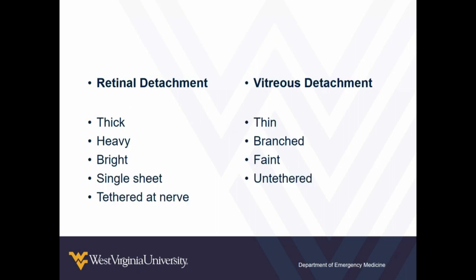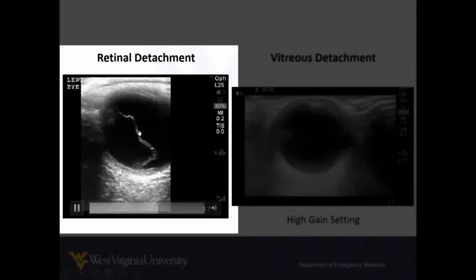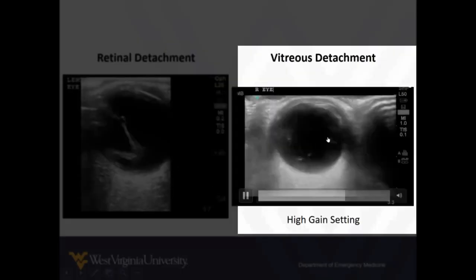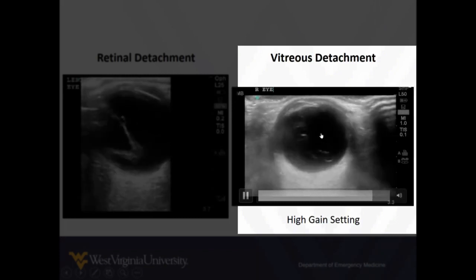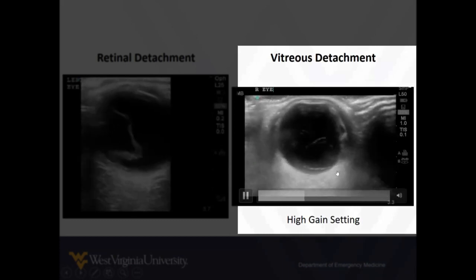Let me break these down because they can look very similar. Retina versus vitreous: the retina is thick, heavy, bright, a single sheet, tethered at the nerve. Vitreous detachment is thin, has branches, not as well defined, and it's not really tethered anywhere — you usually have to turn the gain up a little higher to see it well. As visual examples: big, thick retina versus less distinct branching vitreous detachment. You see how bright everything is around it, because we've turned up the gain a lot to see it well.